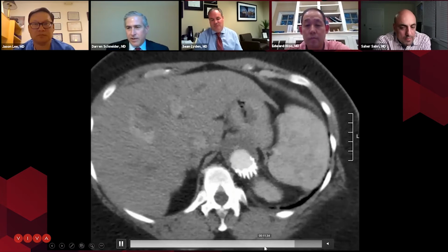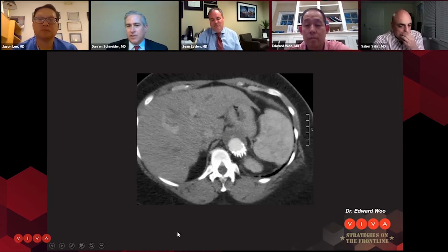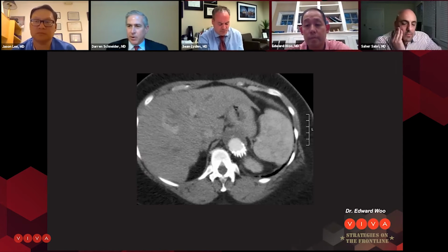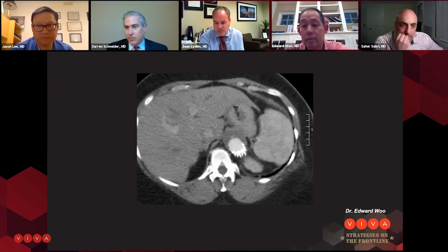One question for you, Ed. When you size these for a chronic dissection, how are you sizing your endograft? I know in this case you're probably sizing it adequately, so with the Knickerbocker you could get to the true diameter of the aorta in that location. But did you go beyond that, oversizing beyond that? Just by a little bit.